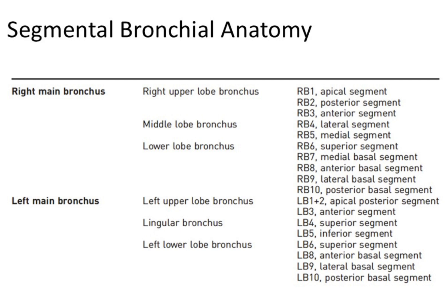Here you can see the bronchial anatomy. On the right we have the right upper lobe with the RB1, the apical segment, the RB2, the posterior segment, and the RB3, the anterior segment.